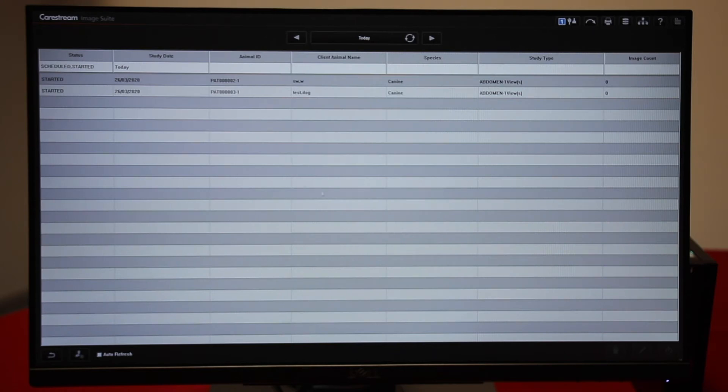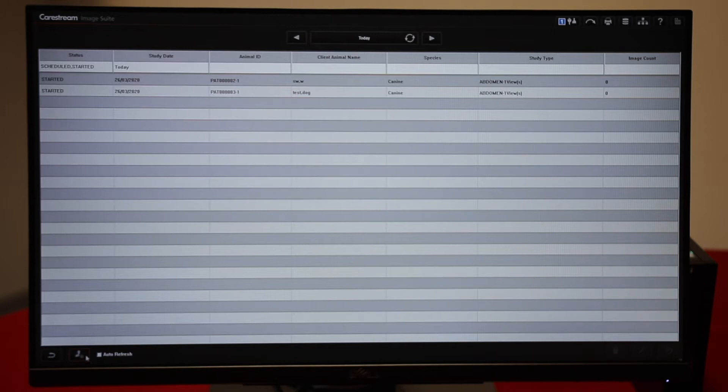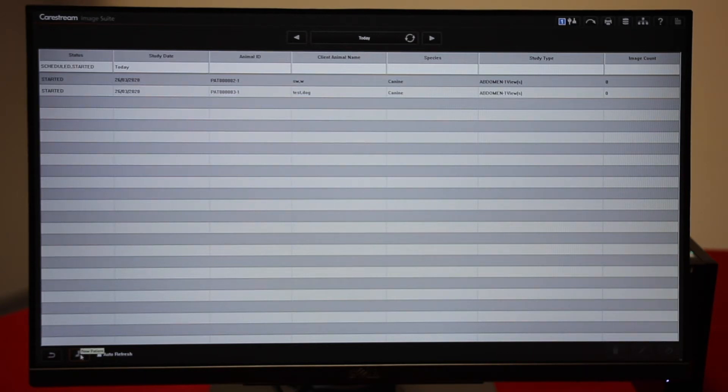This is the worklist and it shows only today's patients. Down at the bottom left of the screen, we can add a new patient.